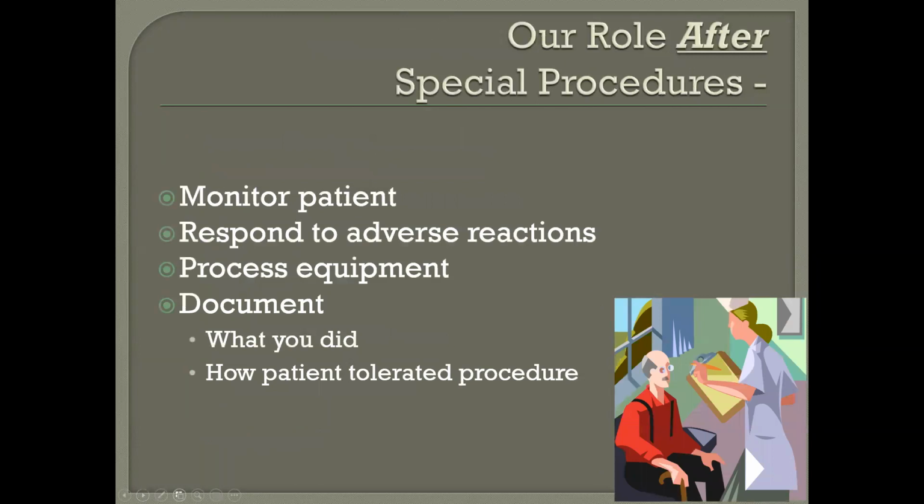After the special procedures, again, monitoring. This is not a typo. You're monitoring them before, during, and after, and you're documenting. Before the procedure, what their sats were, what the heart rate was, during the procedure at appropriate intervals, and after the procedure. You process the equipment, document what you did, how the patient tolerated it, et cetera.